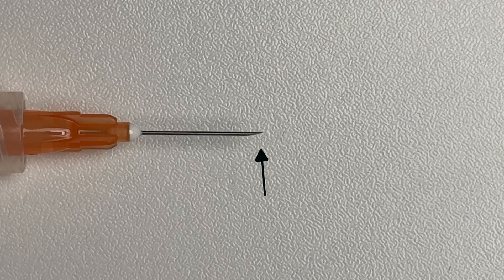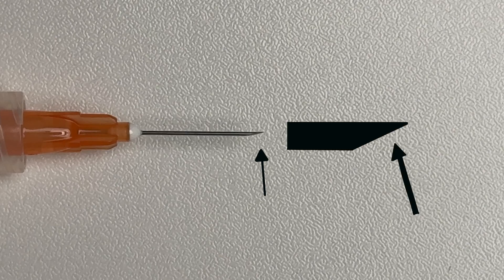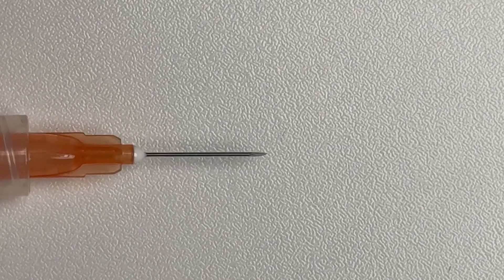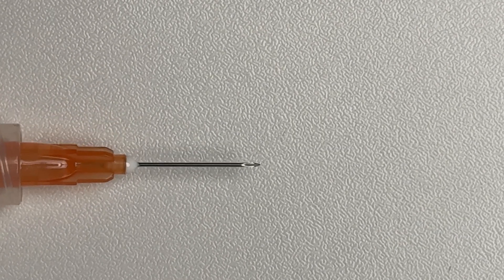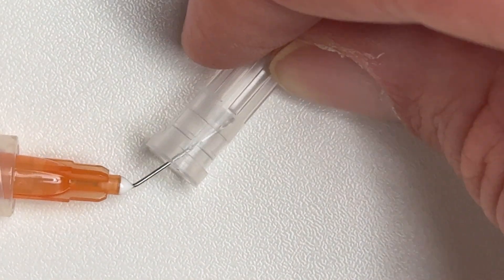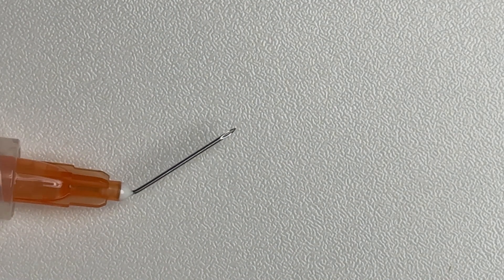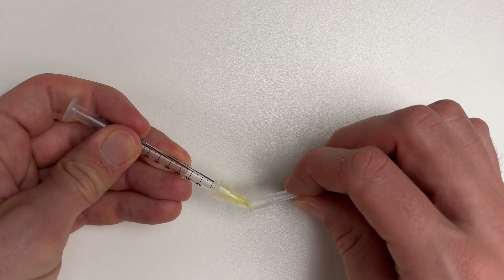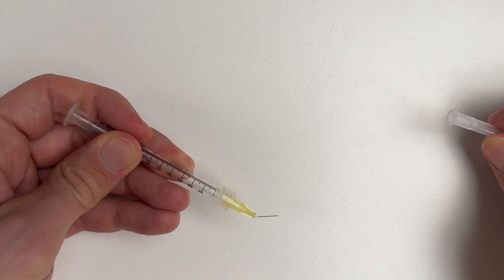First you have to identify the bevel of the needle — it's the sloped part where the needle comes to a point. You want to rotate the needle so the bevel is pointing at you. Then use the cap of the needle to bend it in the desired direction. Make sure you do this in a sterile fashion as this part is going into the patient's eye. Of course, doing it with a 30 gauge needle is exactly the same.